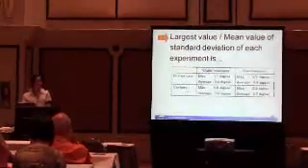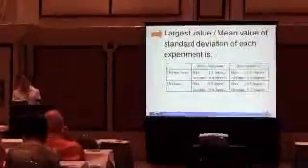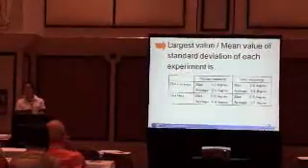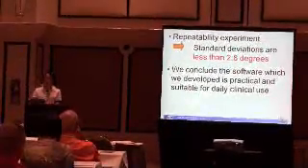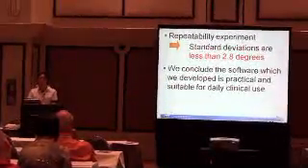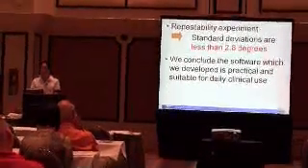Here is measurement using the bar, and here is not using the bar. And here is the inter-examiner experiment. Max value and average value of standard deviation are here. So the result of this experiment is that standard deviations are less than 2.8 degrees. And we conclude that the software which we developed is practical and suitable for daily clinical use.